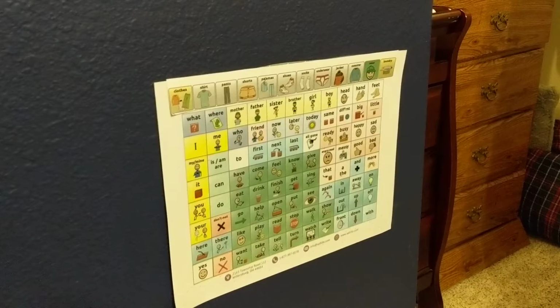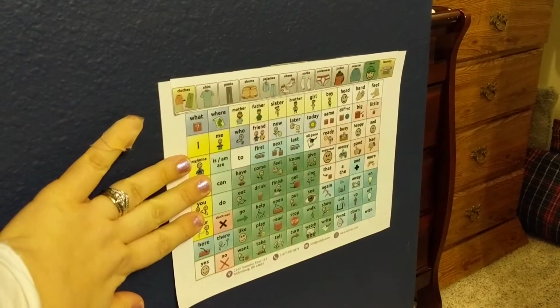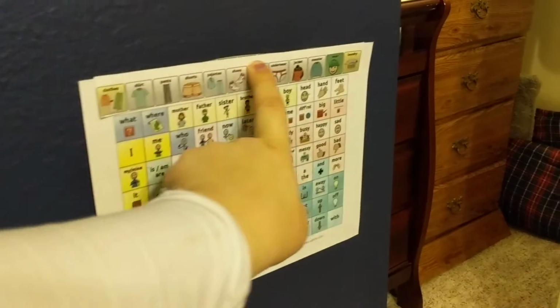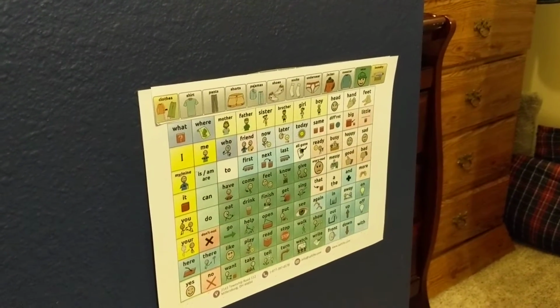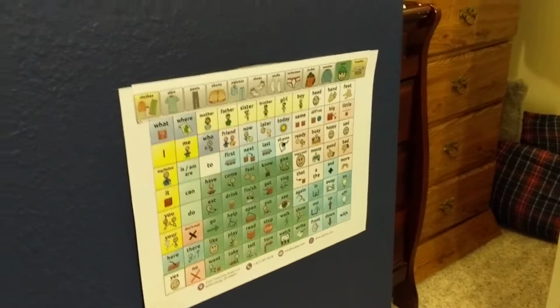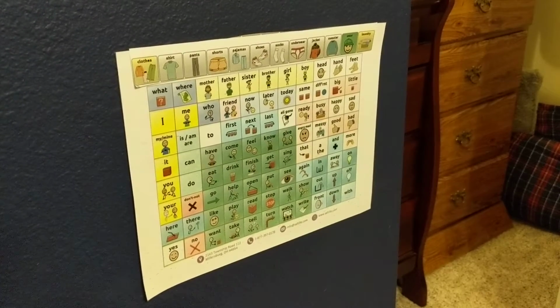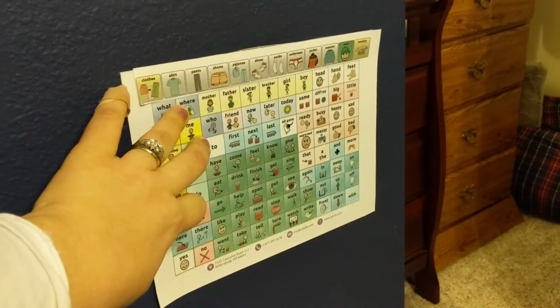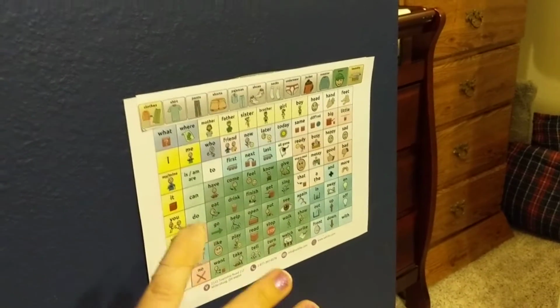This is a continuation of the home series videos showing how you can print off manual communication boards and use the capture feature on the Chat Editor software from Saltillo and make a fringe strip, and then you can use this as visual supports throughout your house. So this video will show how I'm using this visual support in my son's bedroom, and this is by his closet.